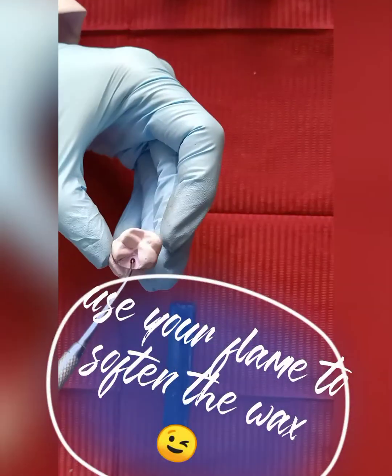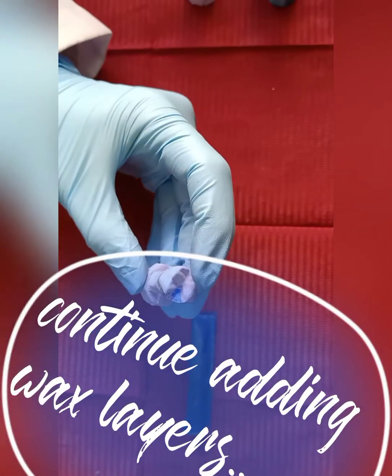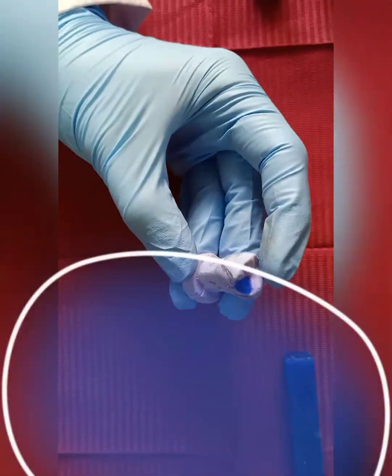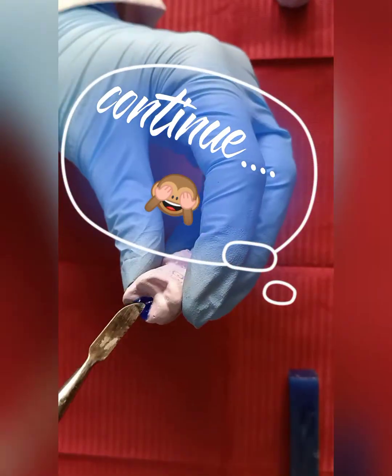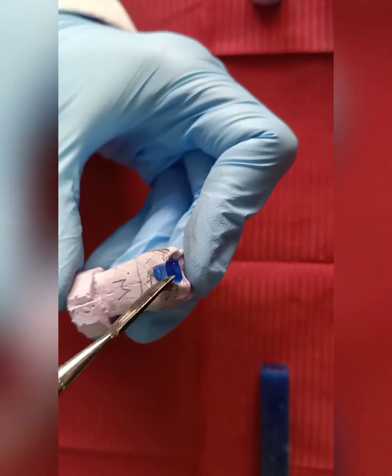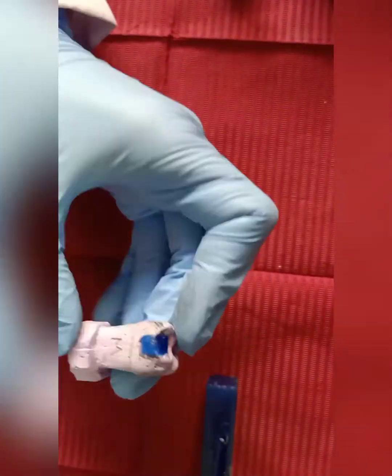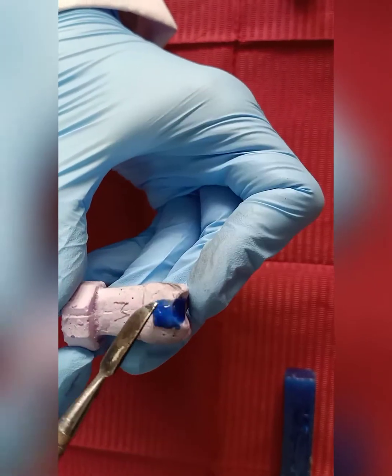Use a wax dropper and a flame to soften the wax. Continue adding wax in layers. Take your time. Let's start using the carver and continue adding wax till you fill the rest. Now moving to the minor connector. Add wax in layers. Keep it smooth, confined to your drawing.